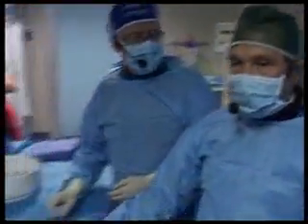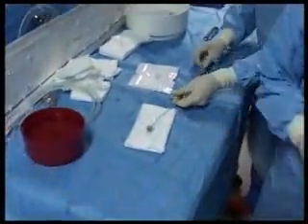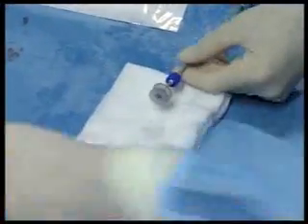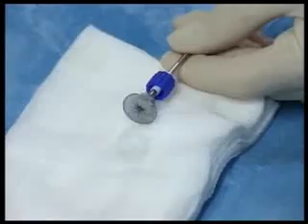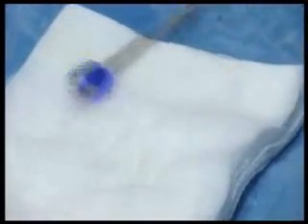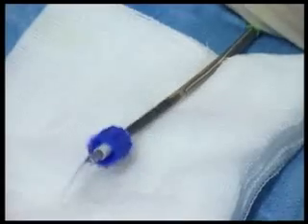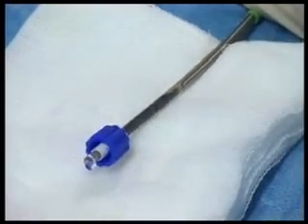Yes. So shall we carry on with this? Yeah, we'll go ahead and load this. It's nothing special. We've got 5 minutes before we go. Here we go. We flash it? Yep. Okay. We are ready to go.